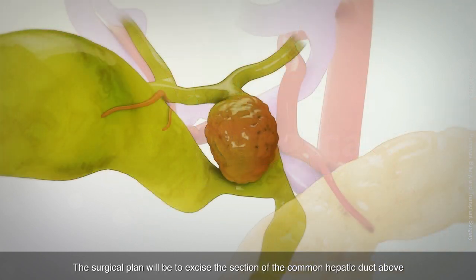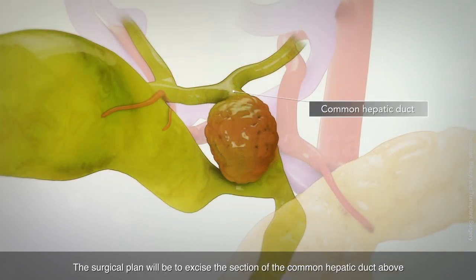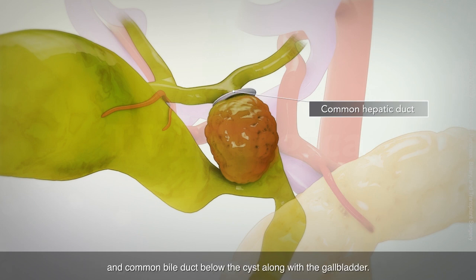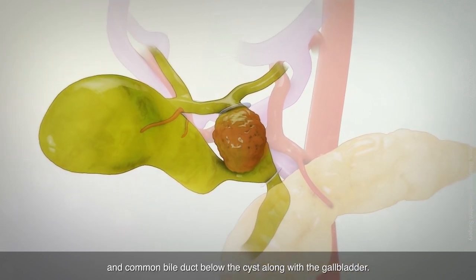The surgical plan will be to excise the section of the common hepatic duct above and common bile duct below the cyst, along with the gallbladder.